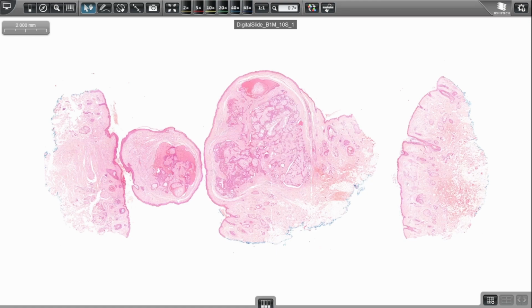In order to get the functionality of the SpaceMouse set up, we need to go onto the web to find the software which you would need.